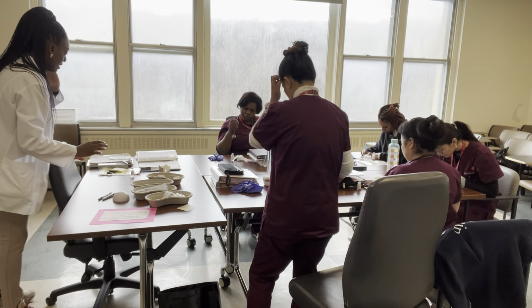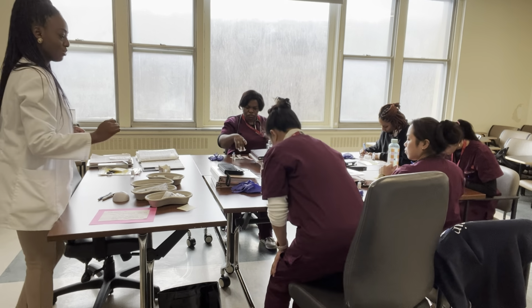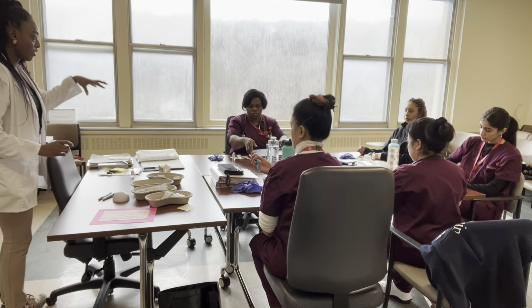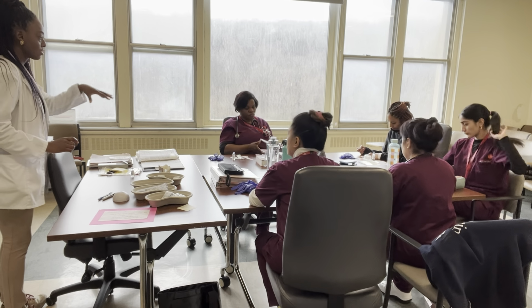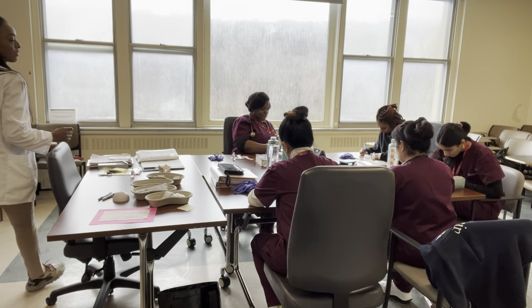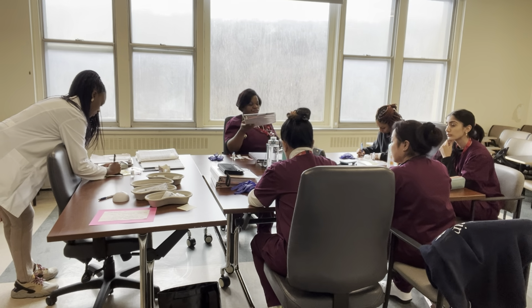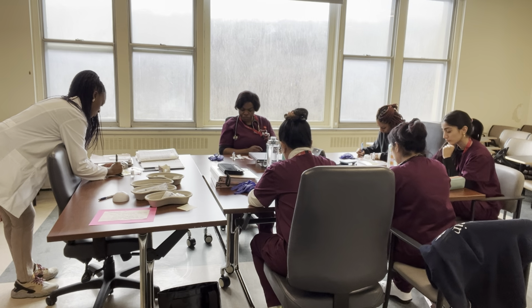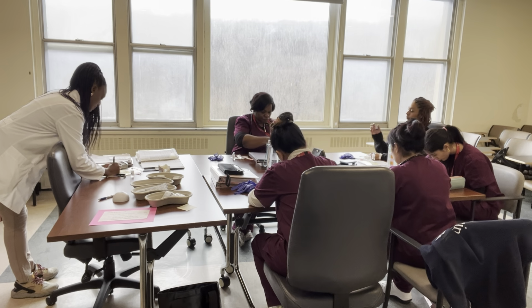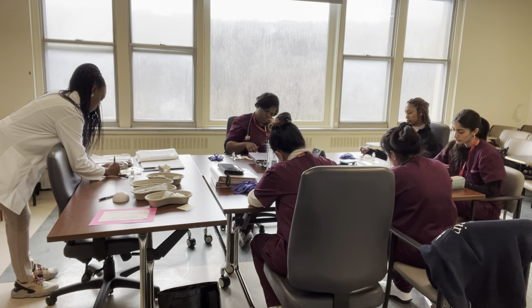So I'll put up on the board the same type of insulin. For you, I'll just give you the amount of insulin you need to draw up. I think it'll be a little bit easier, since we already practiced how to use the insulin protocol. So your patient, we did the check, and we came up with 8 units of Humalog for Madame Anna. Now Madame Cheryl, let's write down. Sherilyn, your patient came up with 12 units of Humalog. Jasmine, your patient had 6 units of Humalog, which you need to administer.